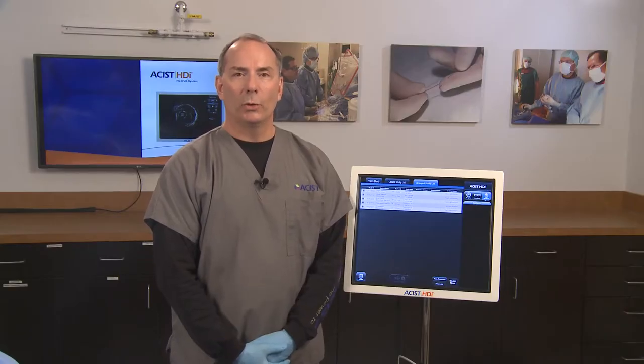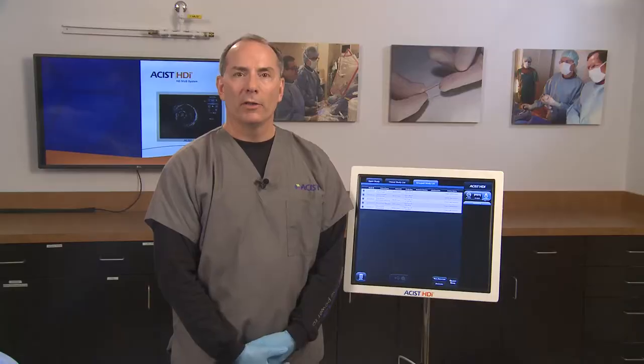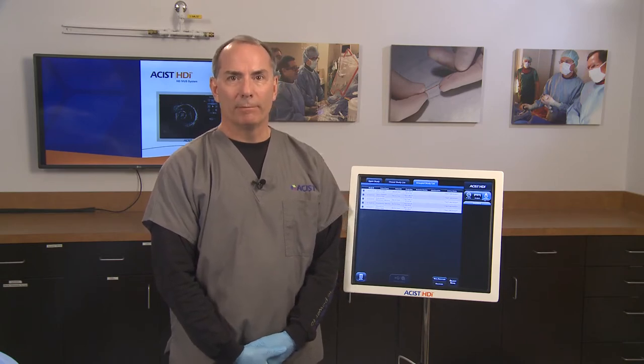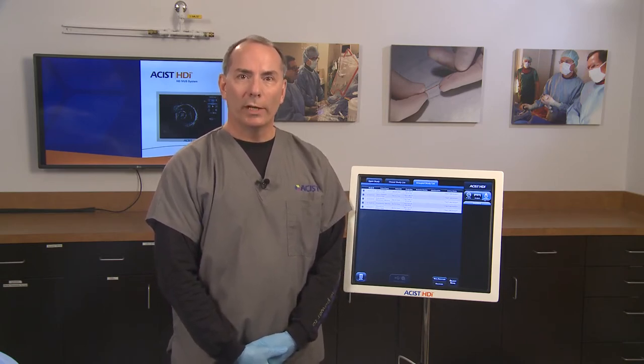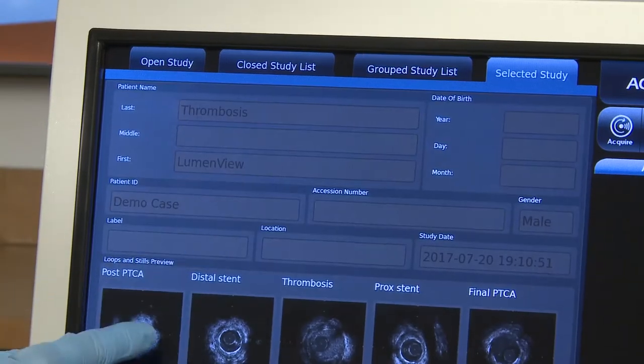After a study is closed, no additional imaging or recording is possible. The controls for starting imaging and recording are disabled in a reloaded study. When a closed study is reloaded, a copy of the study is created with a new study number.